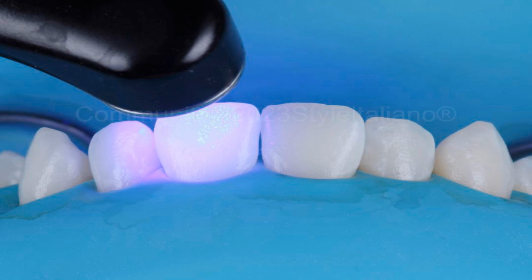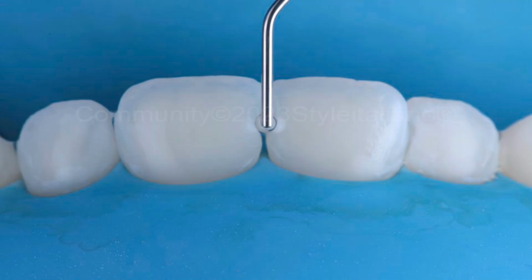This step is repeated with another layer of resin infiltrant being placed, and again cured for 40 seconds for each tooth. The infiltrant is an unfilled resin which undergoes significant shrinkage. Therefore, to counter this, we reapply the resin infiltrant and recure with the same process. After that, a final cure for 20 seconds on each tooth under an oxygen barrier medium, which is glycerin gel.